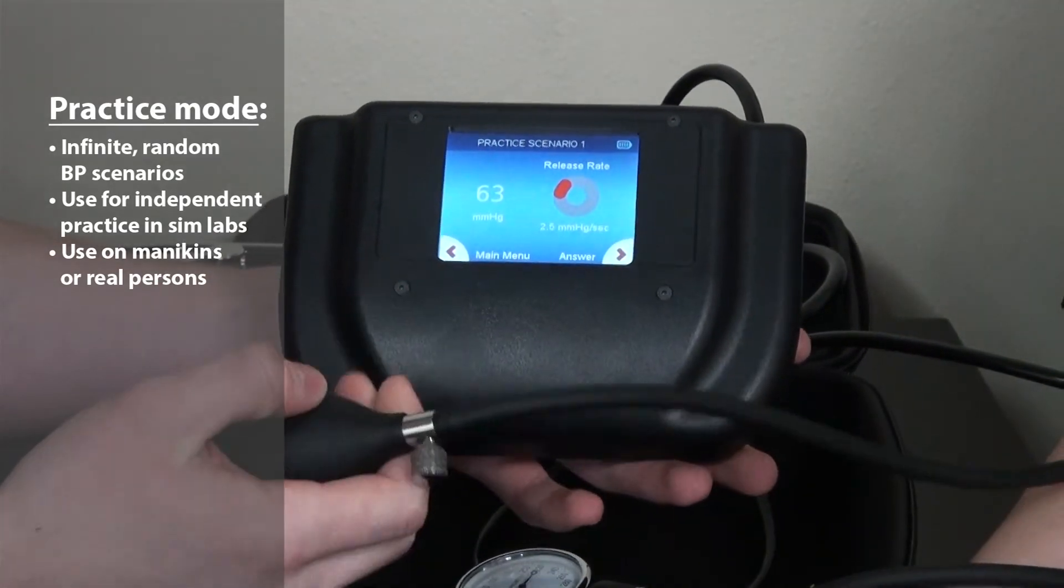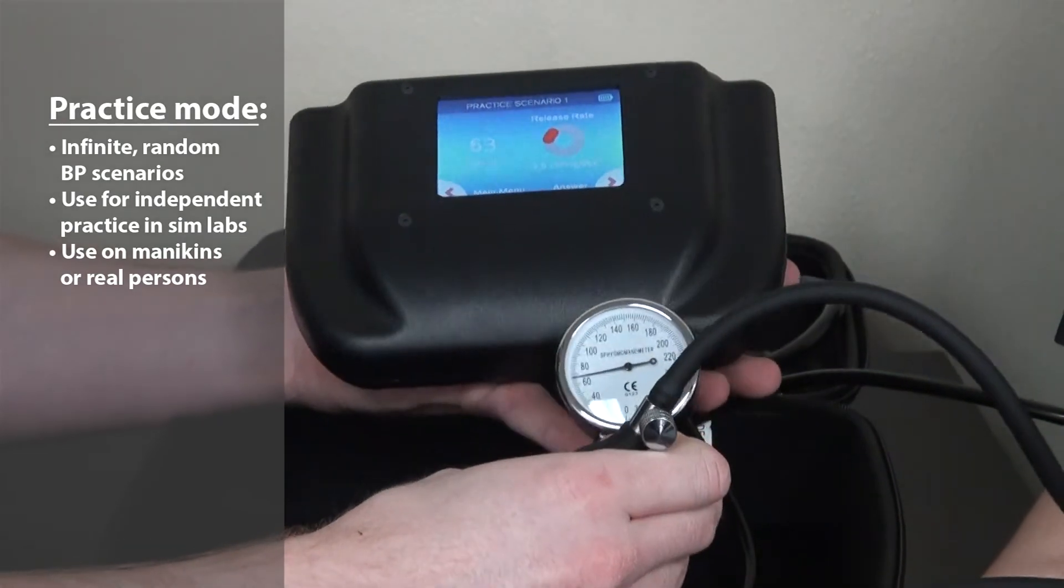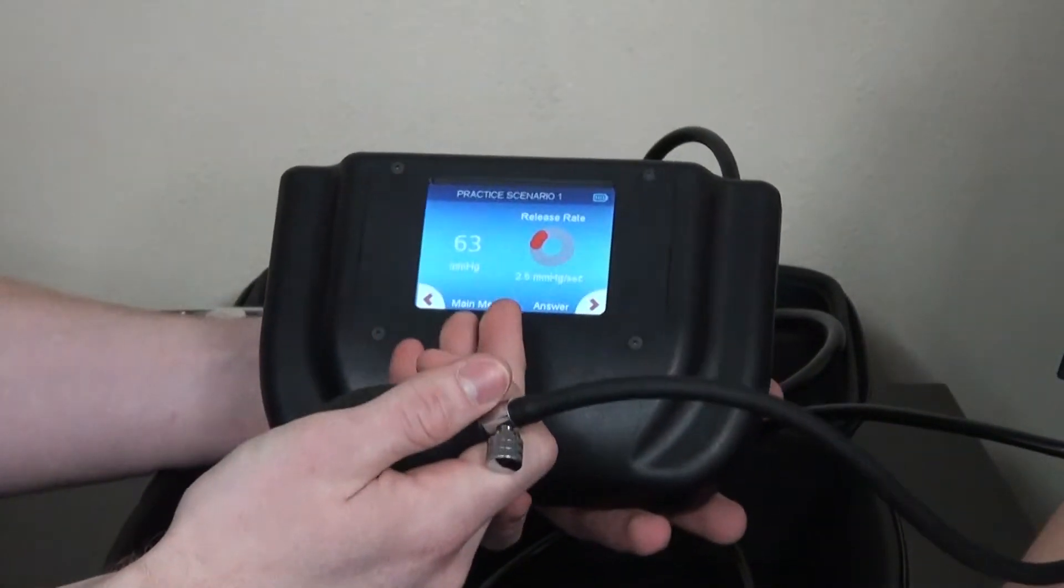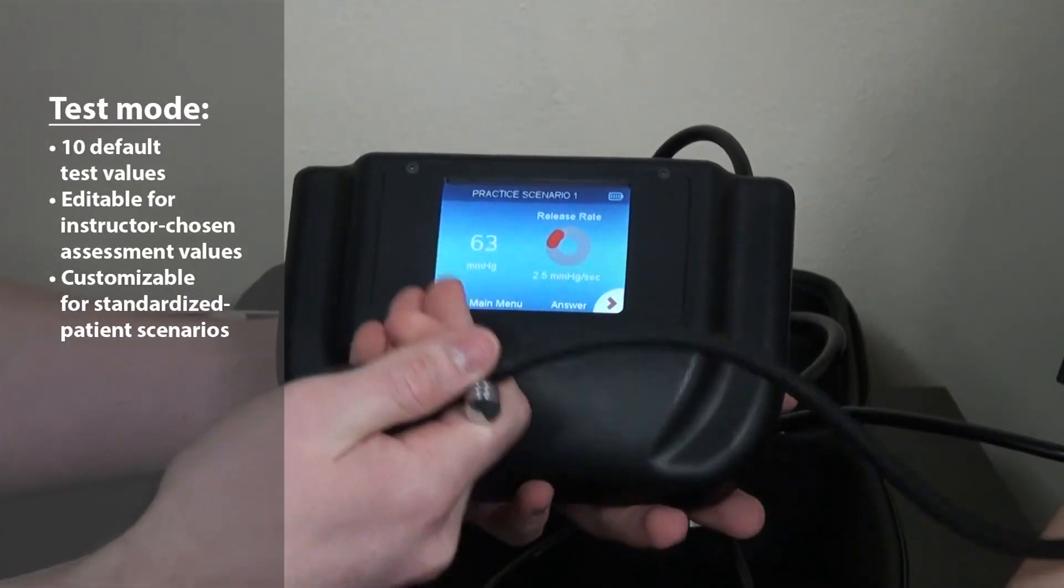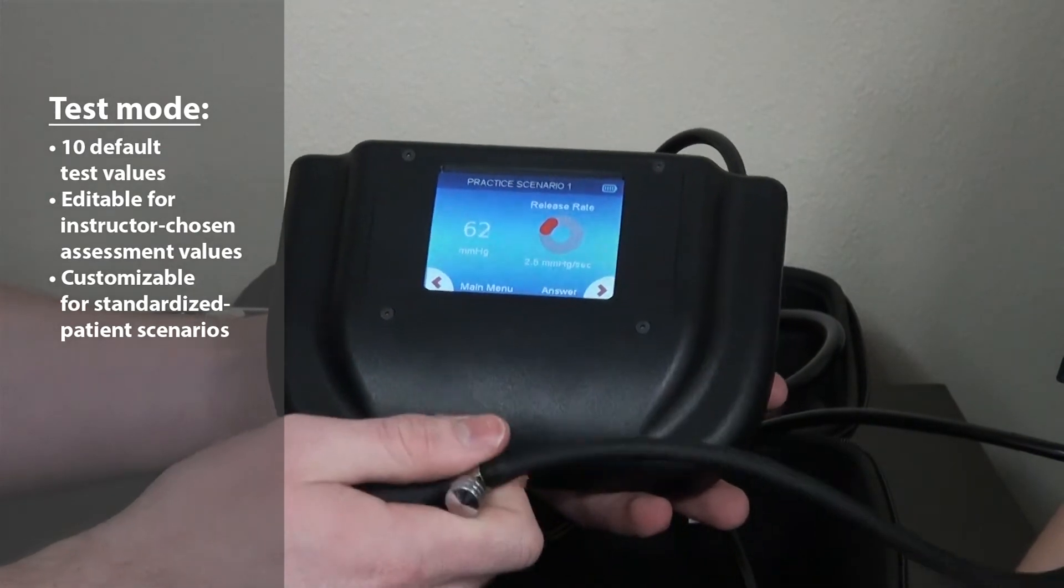The screen depicts the pressure within the cuff that's also on the analog gauge, as well as the release rate showing a too low, too high, or correct release rate.